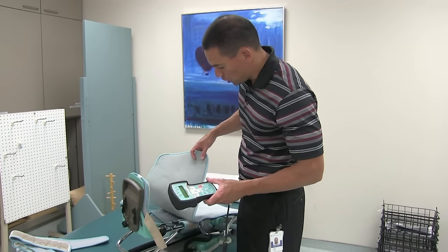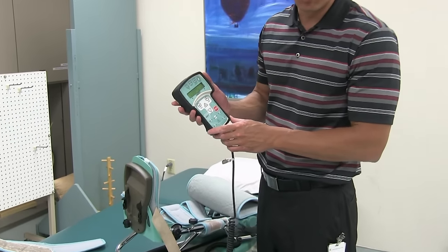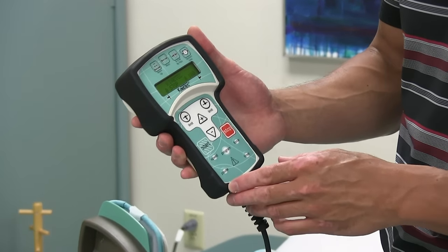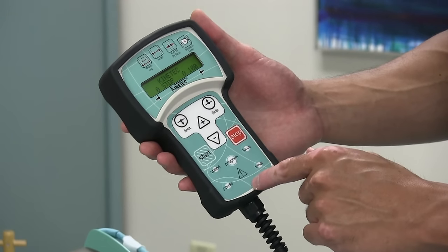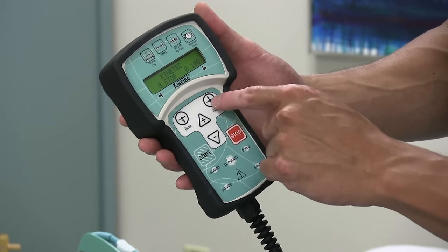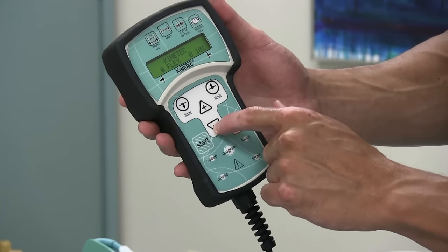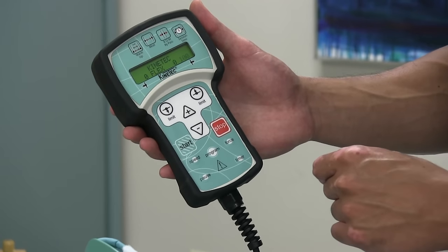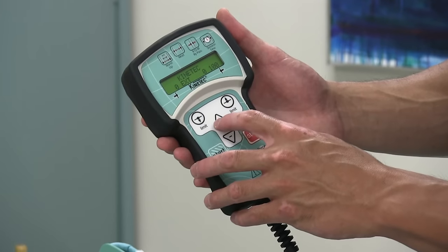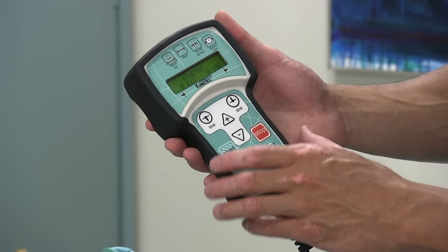The key components of the CPM machine are the remote, which allows you to set the flexion and extension for the individual. Most remotes have a flexion limit and an extension limit. Generally, when you press that button, the limit will start to flash and then you use the up or down keys to set the amount of range of motion desired by the surgeon. The same applies with extension — you can limit or increase the amount of extension based on what the surgeon has requested for that individual.